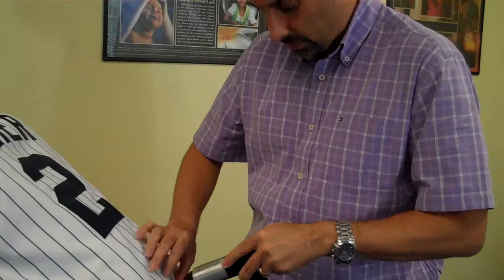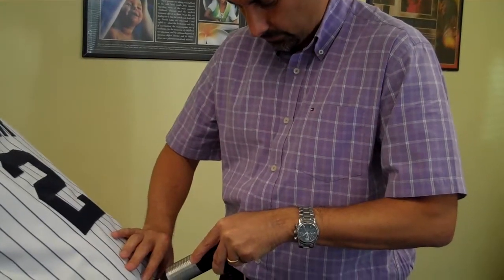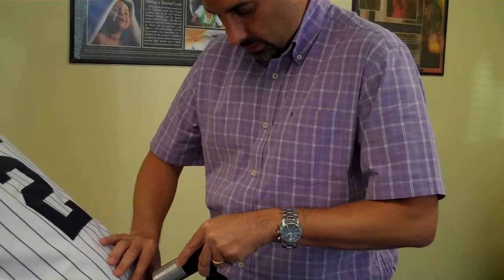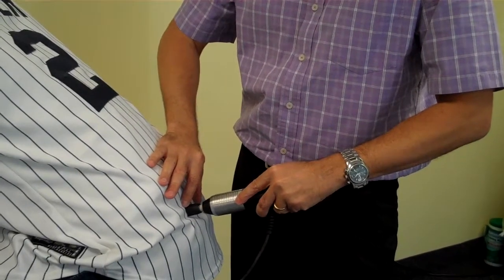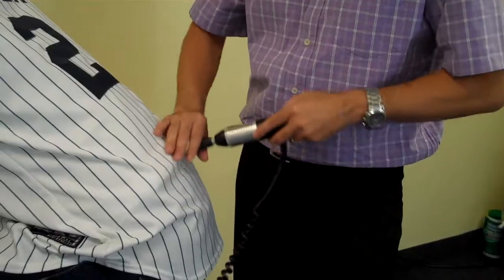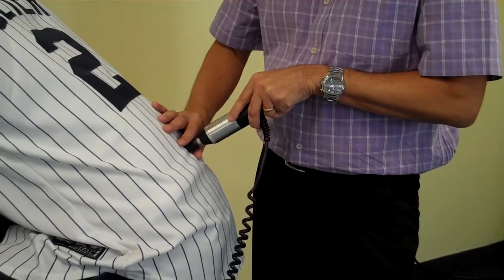We're going to go through some paraspinal muscles, just the trigger points that you palpate, utilizing it until the instrument auto shuts off. We're also going to do this in the cervical spine around the areas where the muscles are really tight.